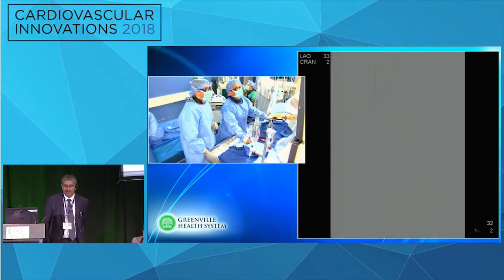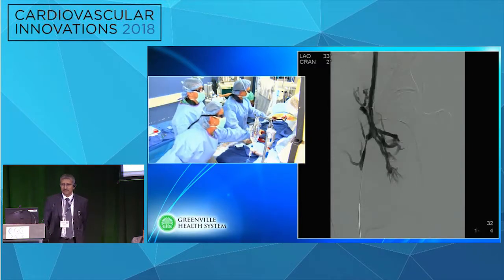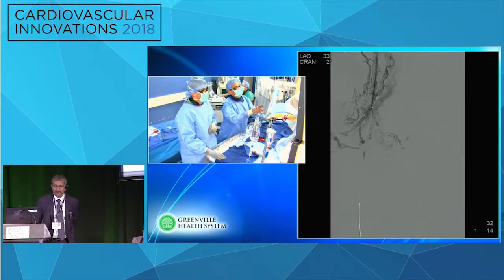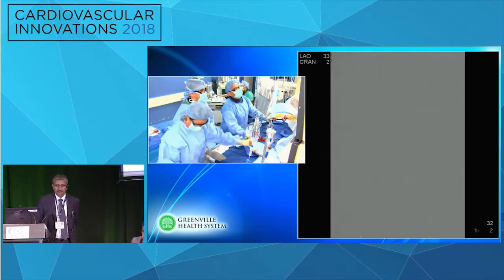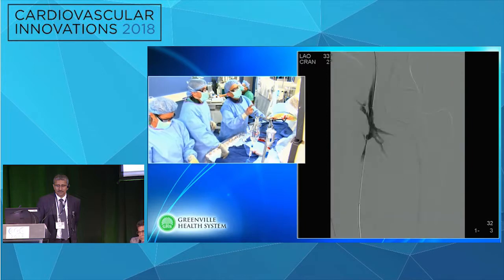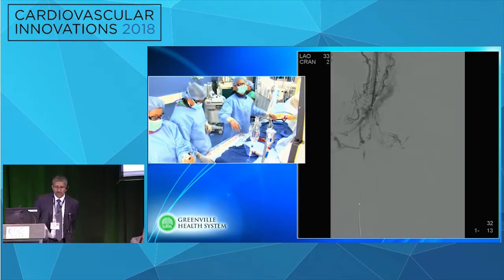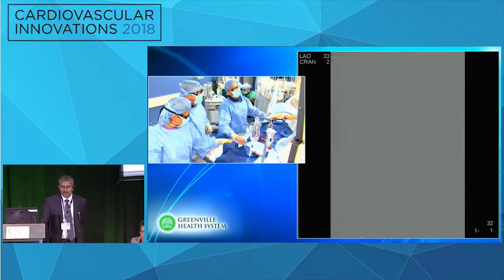Yeah. I appreciate everyone else's comments, but I think that common femoral vein is going to be a nidus for restenosis and thrombosis, and I'd probably stay. I can't make a stent decision yet, so I'm going to need to get into something else in the thigh. Let me put the wire in between where the profunda and the saphenous is, and see if that makes a difference. But you would leave this wire right there, is that right? Yeah.